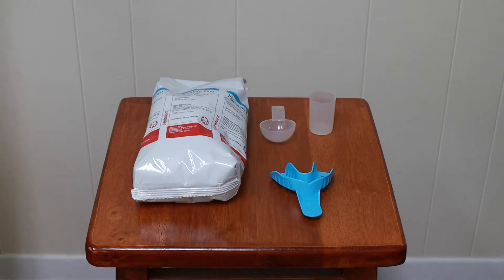Hey Dental fans, Dr. Rich here, and in today's video, I'm going to show you how I take an alginate impression of my lower teeth so that I can make a new bleaching tray for myself.